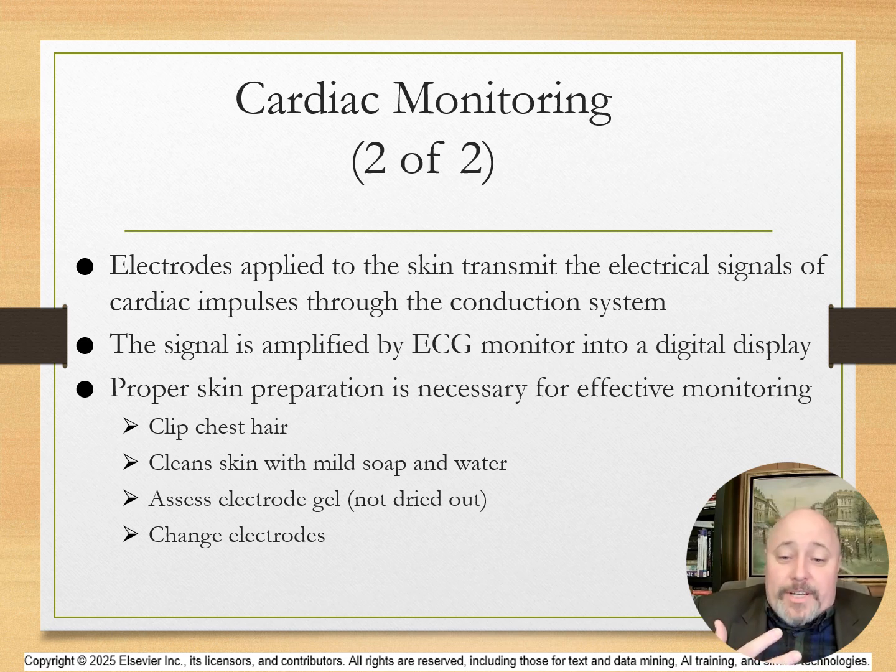You want to clip the chest hair. You want a nice, clean, smooth surface. Cleanse the skin with mild soap and water. Assess that electrode gel. Change the electrodes if necessary. We're going to do everything we can to get as clear of a picture as possible.